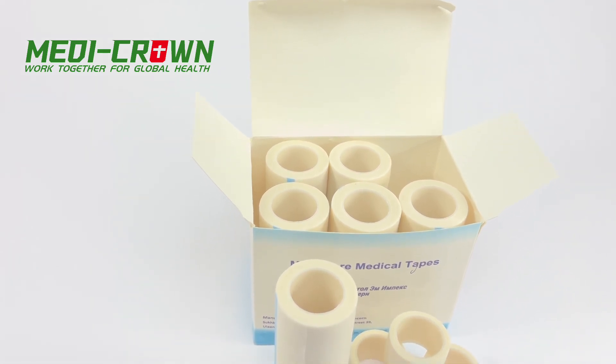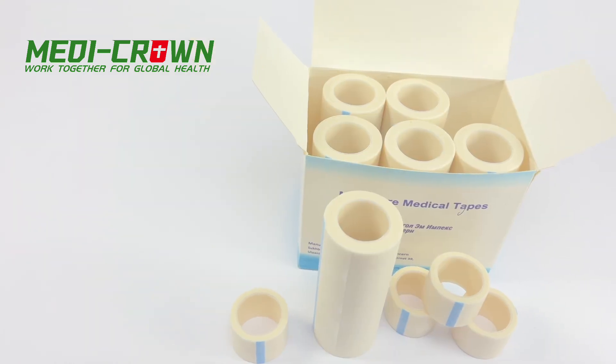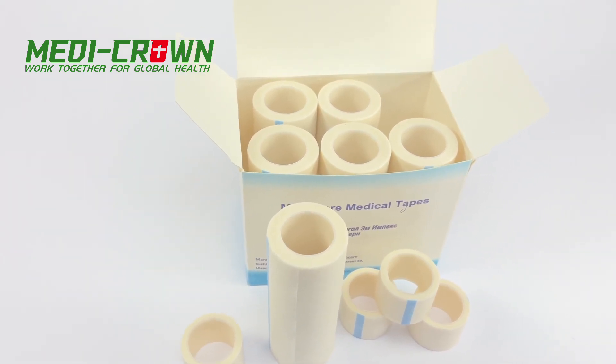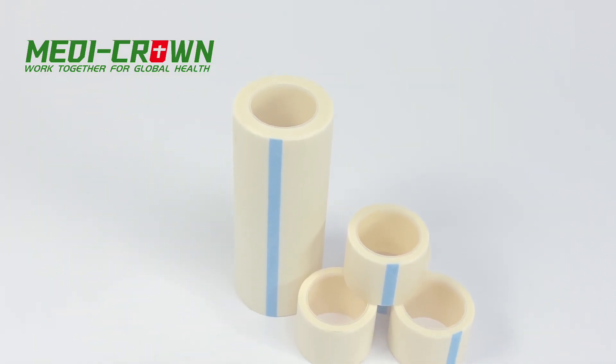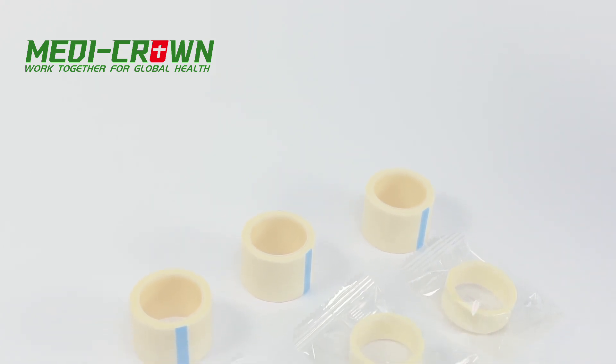Medi-Crown Surgical Paper Tape is a type of adhesive tape used to secure bandages, dressings, and wound care products. It is a thin, paper-like tape that is porous and breathable, allowing the skin to breathe and helping to prevent infection.